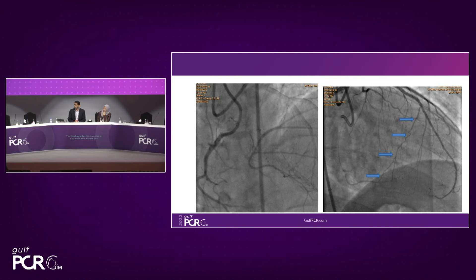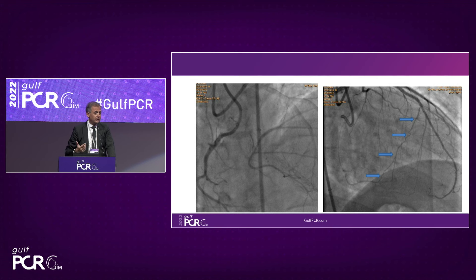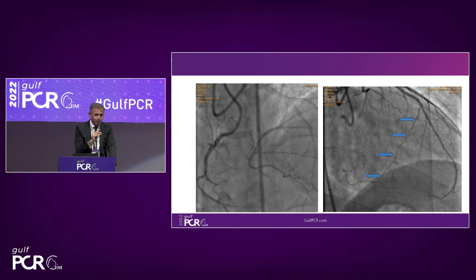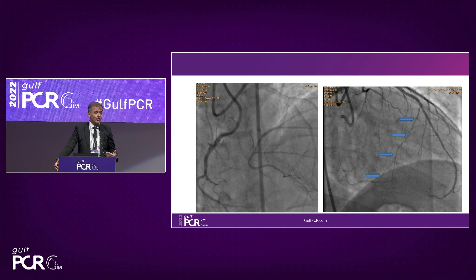When doing antegrade, you need to inject from retrograde to see the distal vessel. When doing retrograde, you don't need to inject — this is a very important point. Also in this complex case with a previous antegrade failure, when you have the distal cap at the bifurcation of the crux and you insist antegradely, there is a high risk of dissecting the distal crux and losing one of the two branches. This is another important point in favor of retrograde.